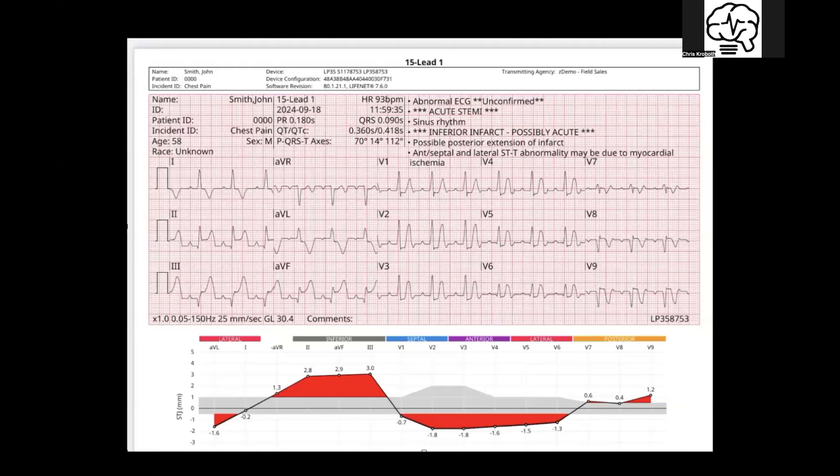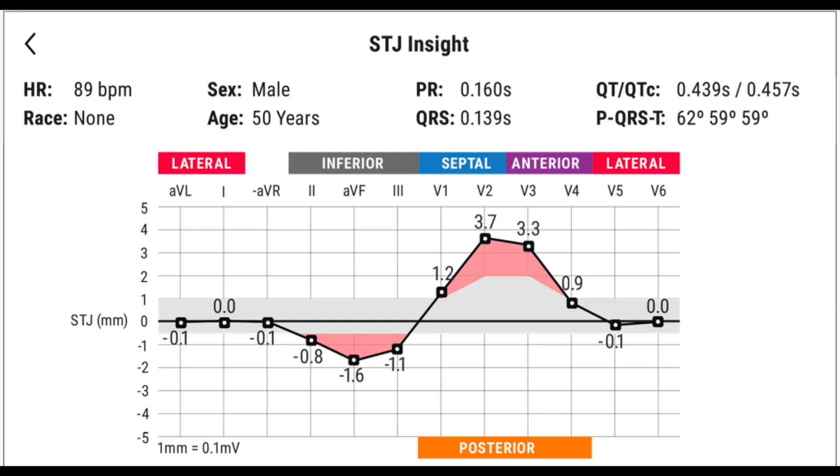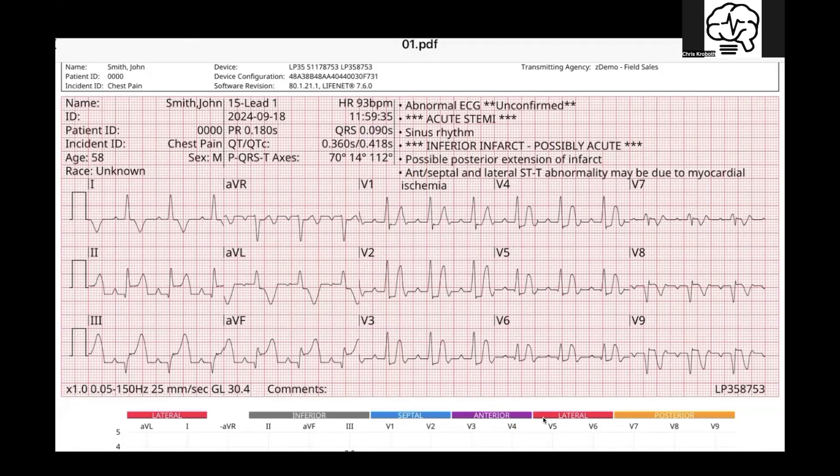Not only do you get the high-res 12-lead in this instance, I also wanted to show you what a 15-lead printout looks like. So if you're using those auxiliary leads and you label them 7, 8, 9 to get that posterior aspect, here you go. Plus on the STJ insight, it now drops the posterior from down here on the 12 over because it has signal uptake in the posterior aspect — so it's not just giving you what would be opposite of it. In the anterior area, it bumps it over and shows you it actually has signal uptake. Look how crisp this is — on an iPad, you can zoom in and zoom out just like any image file.